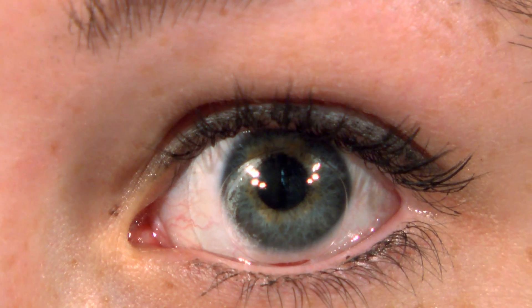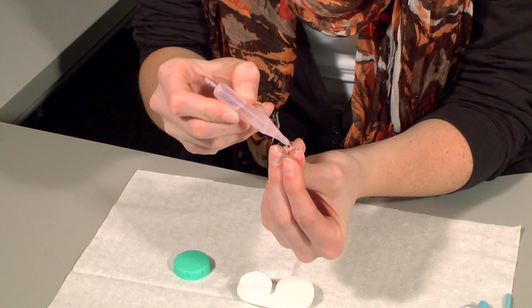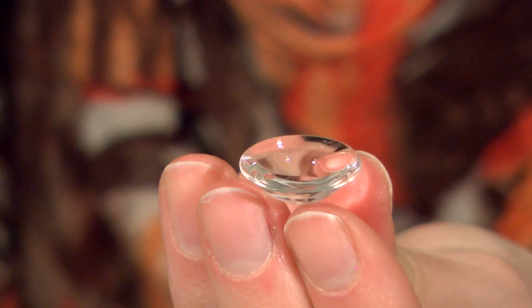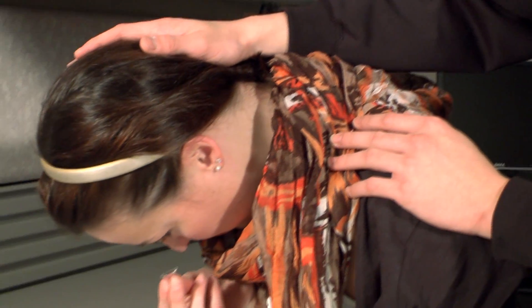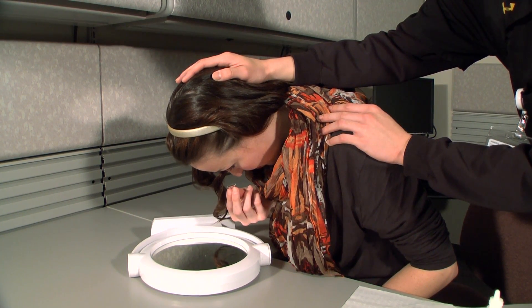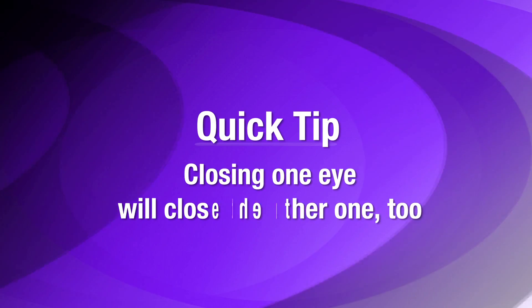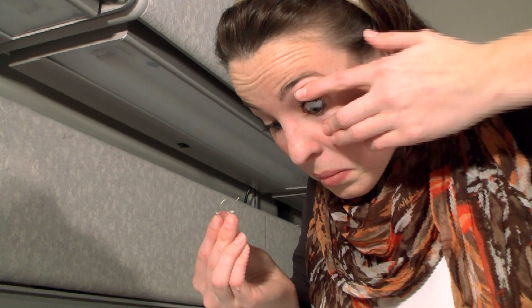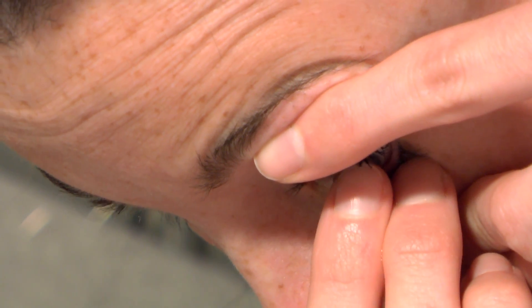Air bubbles will make the lens move on the eye, making it uncomfortable, and it may also be difficult to see through the lens. If you can't avoid air bubbles, it's highly likely that you're unable to maintain fluid in the bowl during insertion or haven't been filling the bowl with enough fluid. Make sure your face is fully parallel to the floor as you bring the lens toward your eye — it may seem like you're nearly standing on your head when in the correct position. Try keeping both eyes open as you apply your lenses; when you close one eye, the other will want to close too. Lid control is essential — make sure the lids are dry and use one hand to hold them completely out of the way. Don't release the lids until the lens is fully in place and the fingers or plunger have been removed.